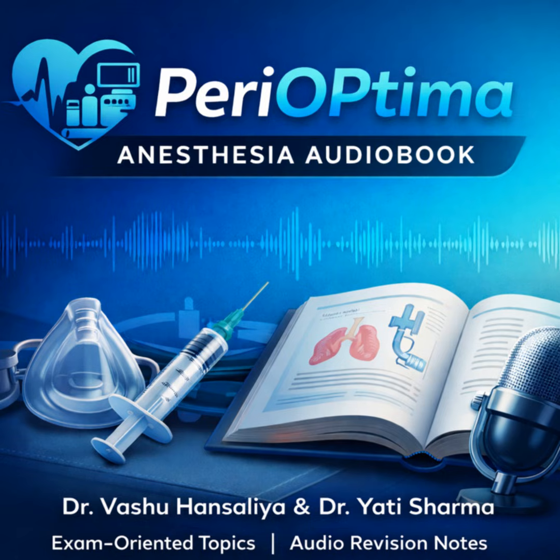Okay, so pressure regulators are absolutely essential for functional safety. Their purpose is to take that extremely high and variable cylinder pressure, which can be up to, what, 2,200 psi for an O2 cylinder? Easily. And it reduces that down to a safe, constant working pressure, which is typically maintained between 45 and 55 psi. And that constant pressure is vital. It is, because all the internal machine components, like the flowmeters and the proportioning systems, are calibrated and designed to work reliably only within that very narrow pressure range.